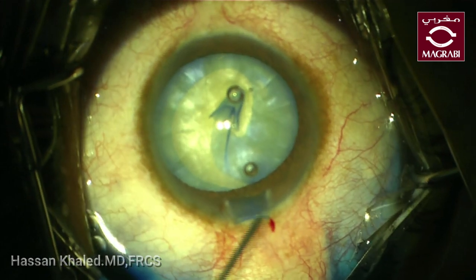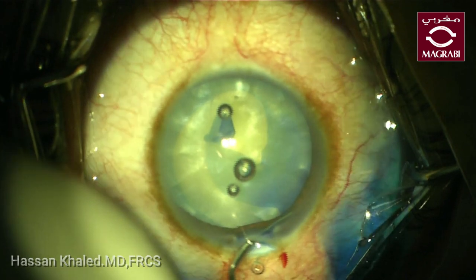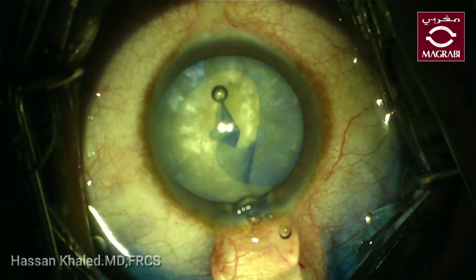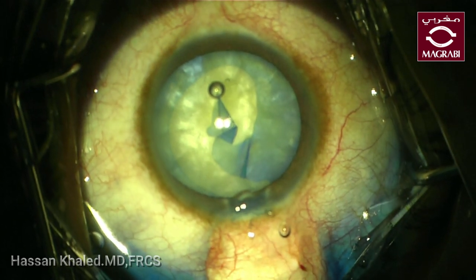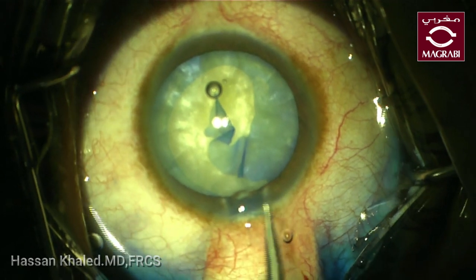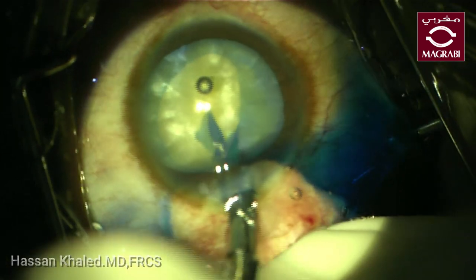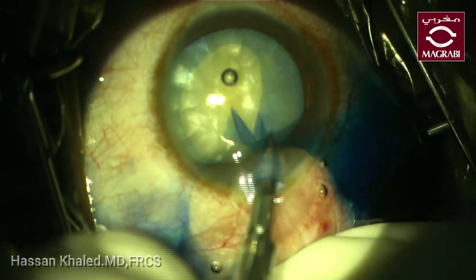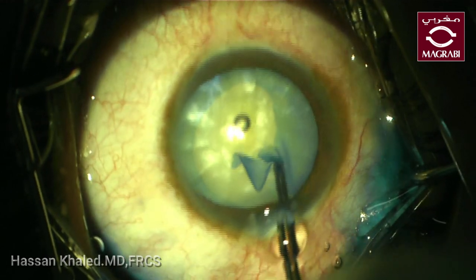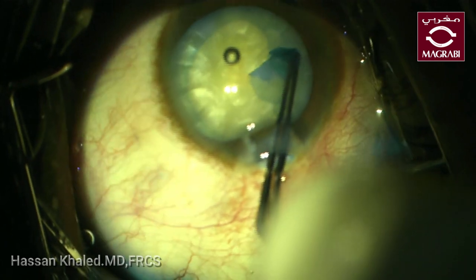Now I will use micro scissors to make a small snip in the anterior capsule to complete this rhexis. You can see the extension goes behind the iris and I can't see the edge of the extension. Here are the micro scissors making a small snip, then using the rhexis forceps to complete the anterior capsulorrhexis. You can see the capsule rhexis with peripheral extension at eight o'clock.